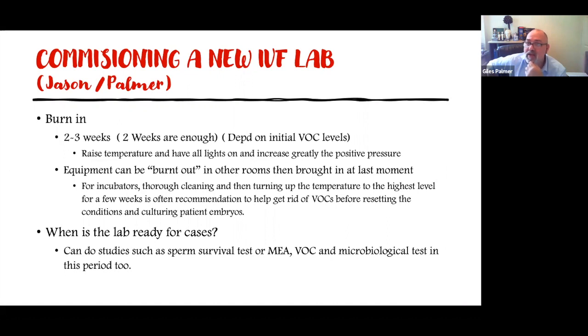At one particular project, I turned my back. All the workmen knew about low VOCs, they were highly educated. And when I came back, some of the hospital staff were putting regulatory signs on the wall, and they were using benzene-based glue. So we had to stop there, and that was delayed for another 10 days while we completely cleared that away. So again, the trick is, I think, to always be present and always make sure that people know the ideal situations.